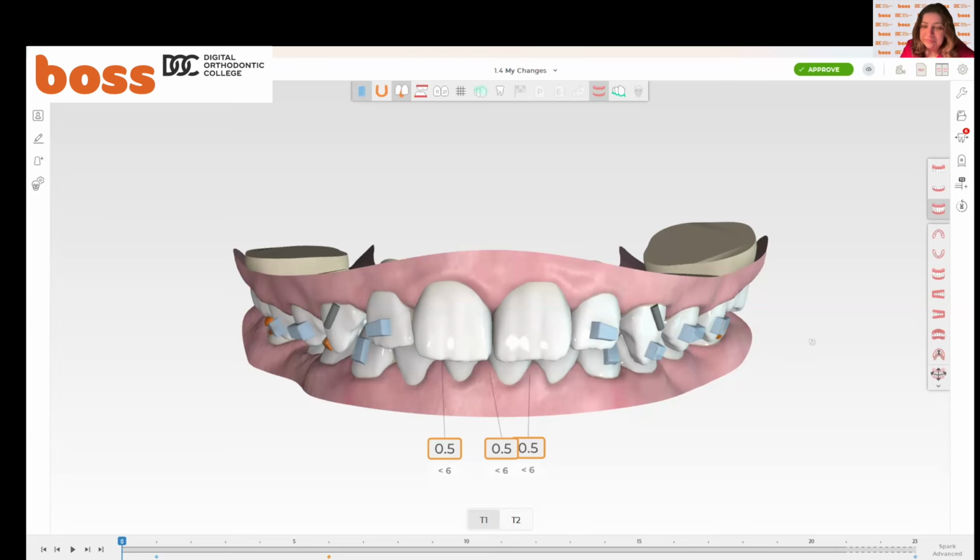Actually, what happens? Dentoalveolar development. Okay. You encourage the dentoalveolus to come up with the root. So it's a bone formation strategy. Okay. You have much more stable deep bite correction. You couldn't do this in an adult. You couldn't take a molar and take it up 2 millimeters because there's no dentoalveolar growth. There's no vertical growth of the bone with that. Here you're bringing bone along. That's the biggest difference in growth, okay?